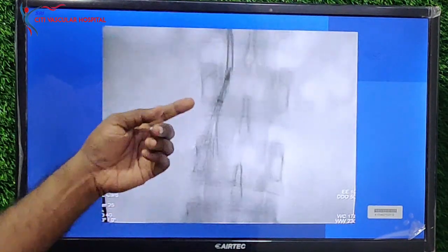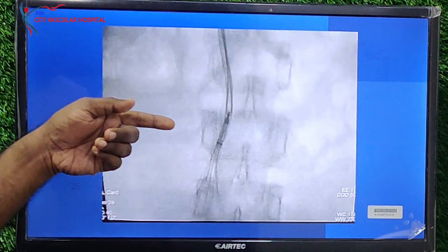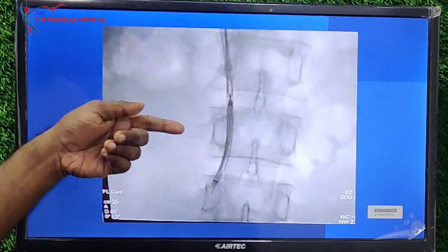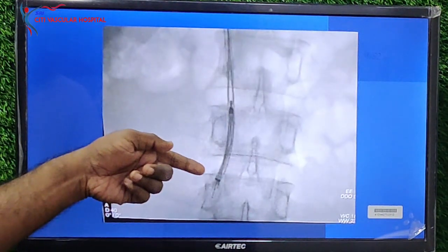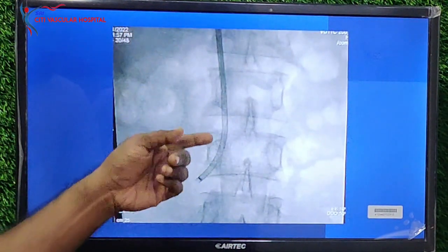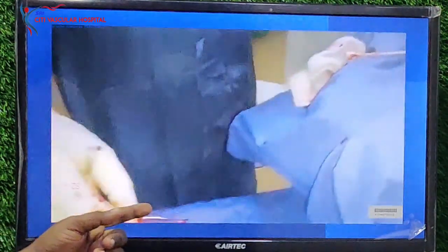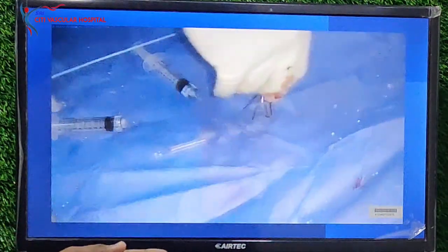Once in position, slowly advance the sheath over the snare, keeping the IVC filter and snare steady. And you can see we have captured it into the snare. Slowly, once in position, we remove the snare. This is how the IVC filter is removed through the sheath.